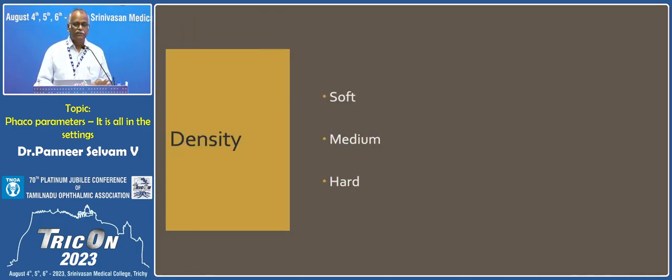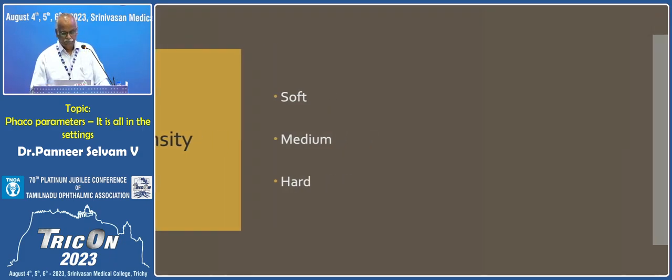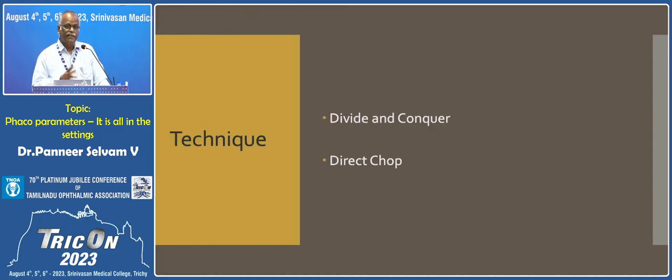So far we have talked about the machine. Now let us look at the cataract. I always look at the density. It is not grade 1, 2, 3. I broadly classify into soft, medium density, and a hard one. For each, the settings differ.